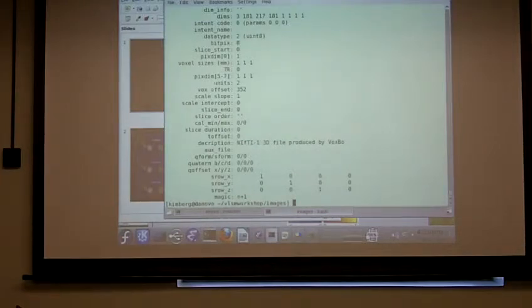There are two places to store an origin. One is as part of the transformation matrix, and the other is in these Q offset fields, but they're not really supposed to be used together. Is it possible that physical origin is something that was calculated by the software you're using from the other orientation information?